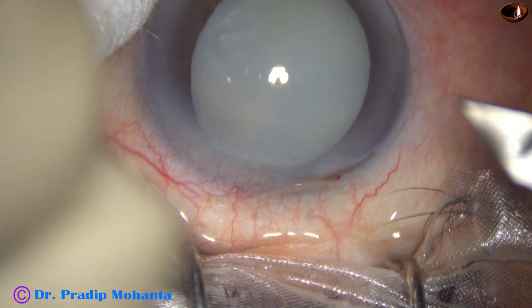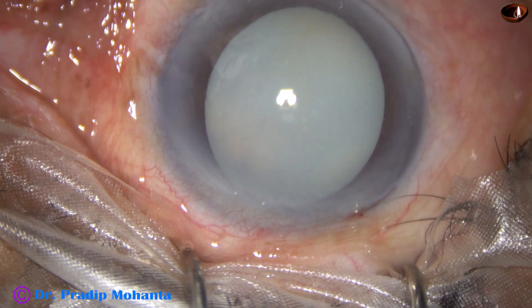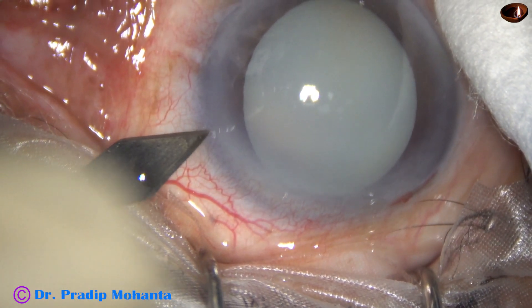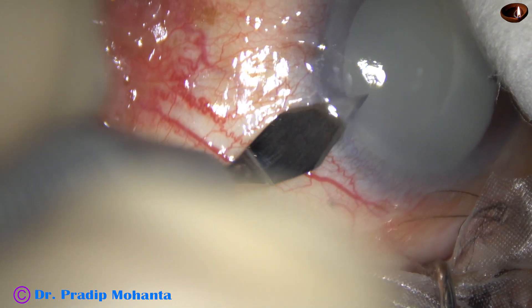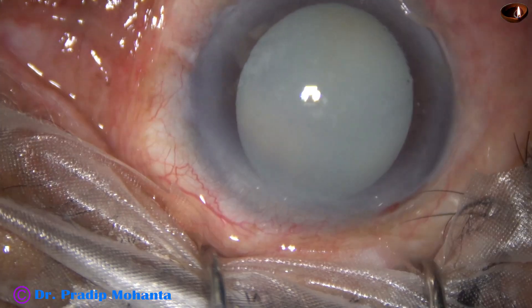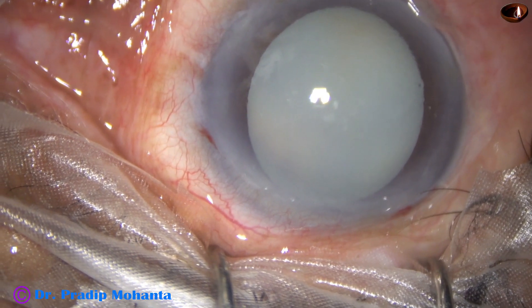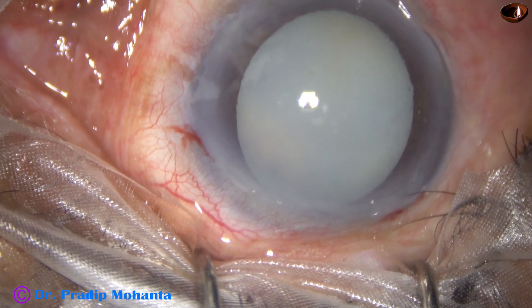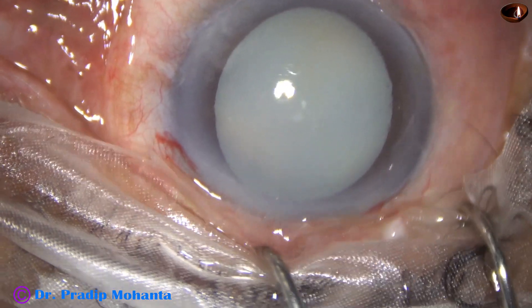As you can see, this is a hypermature Morgagnian cataract. The main incision has been made, this is the side port, and now the anterior capsule will be stained with trypan blue dye.